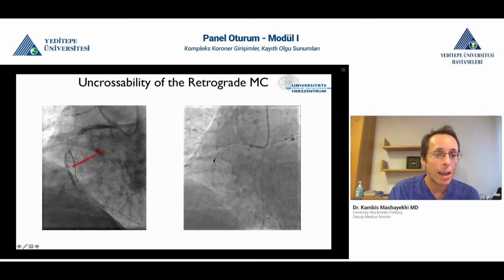And here I had a retrograde undilatable lesion. So can you imagine? Here I didn't go with too high pressure. I stopped at 16 because if you have a balloon rupture, you can't treat that from the retrograde part, right? You would never get a retrograde cover stent down. But finally, I was able to do a reverse CART.